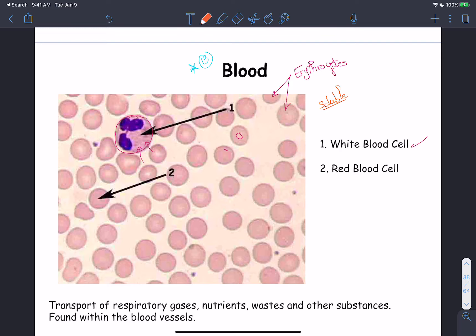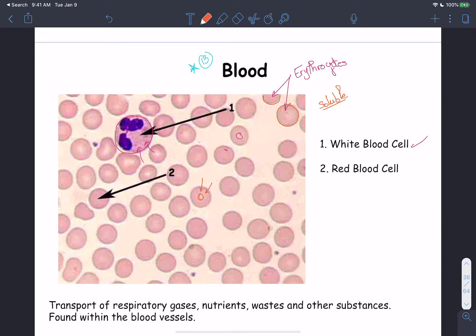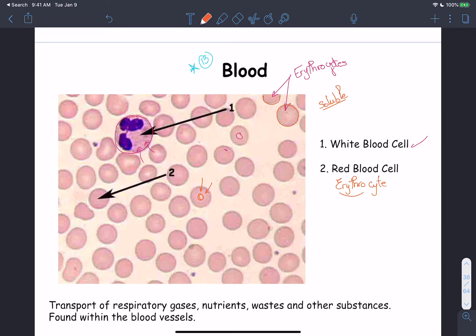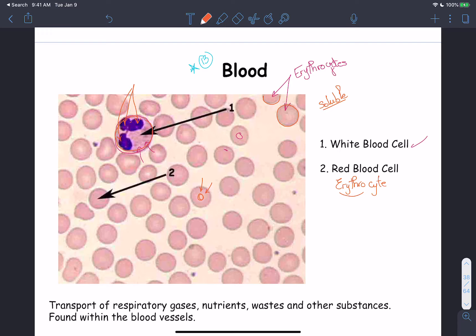On a blood smear, we can see rounded, reddish erythrocytes (red blood cells) with a darker periphery and light-colored center. Also visible are nucleated white blood cells; a specific type with a segmented nucleus and granules in the cytoplasm is the neutrophil — one of the most common types of white blood cells.